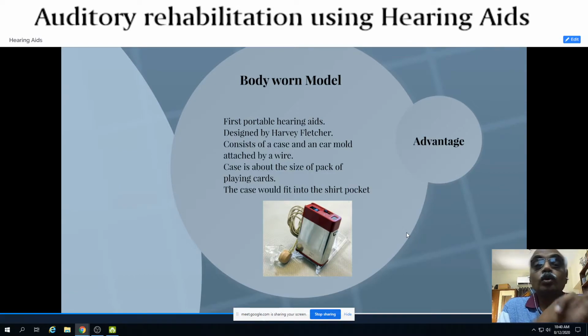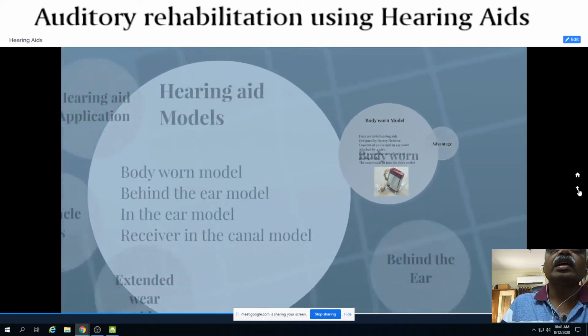I repeat again, to produce or generate 80 dB sound level, one had to use roughly around 28,000 milliampere of electricity. But currently available technology generates 80 decibel of sound with just 3 milliampere of current. So imagine how much efficiency the current generation hearing aids will have.